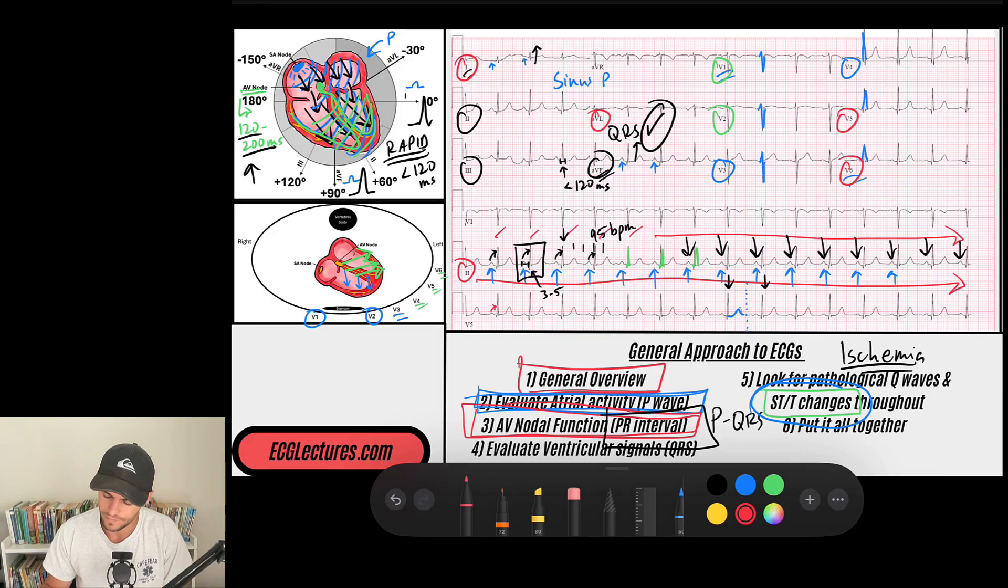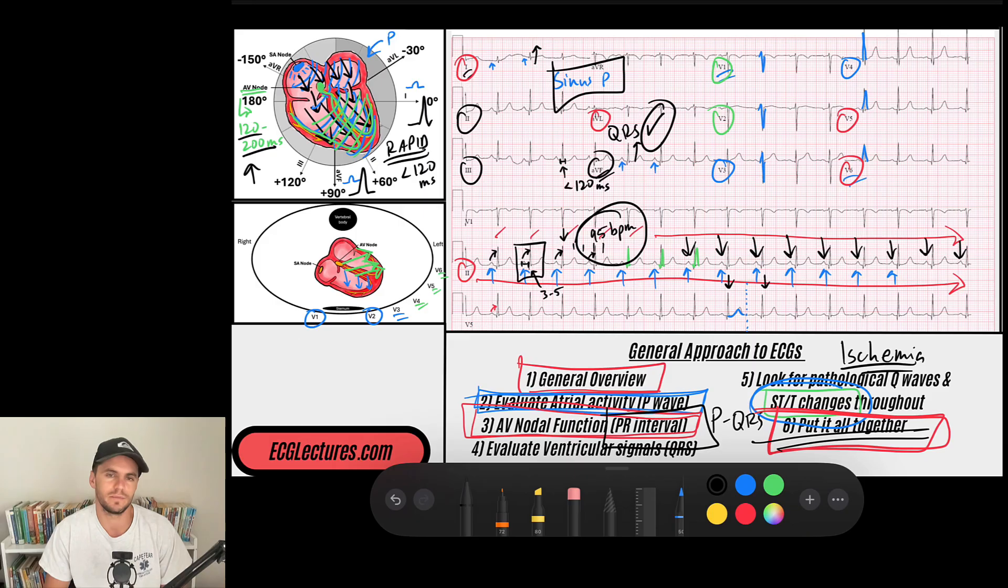And then the last thing we're going to do is put it all together. So steps one through five, they all need to come together and explain the rhythm, meaning does this work physiologically? So in this case, we said we have atrial P waves that are driving the rhythm with normal P and QRS relationships, meaning a normal PR interval. The atria is driving, the ventricle is doing so adequately. We look at ventricular depolarization. Does that make sense? Why is it narrow? How is the axis? Does that explain a supraventricular rhythm in this case? And it does. So ultimately, when we put it all together, we're going to put these findings together and we're going to say we have a sinus rhythm at a rate of 95 beats per minute. And that's that.